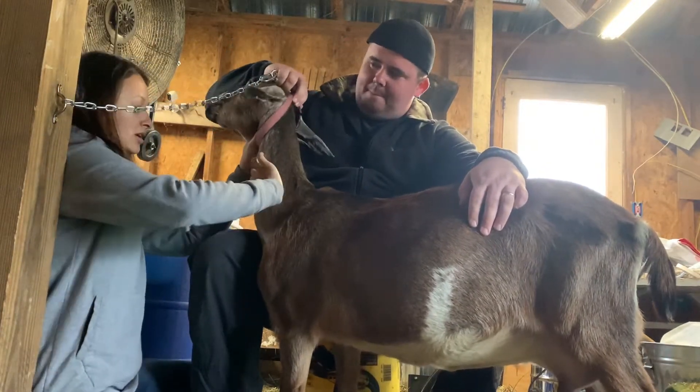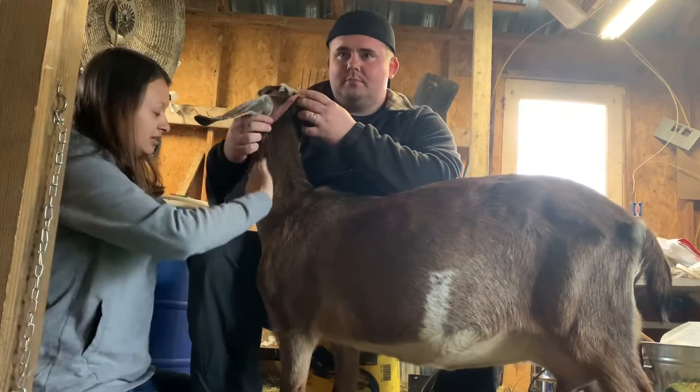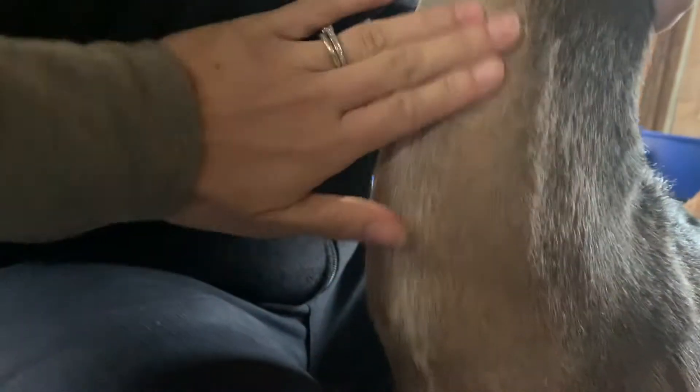I'm going to be the one drawing the lab. You're going to feel along her neck right in here — it's going to feel kind of spongy, like it's bouncing back. That's the vein you're going to be drawing from. So I'm just going to shave this area right here.